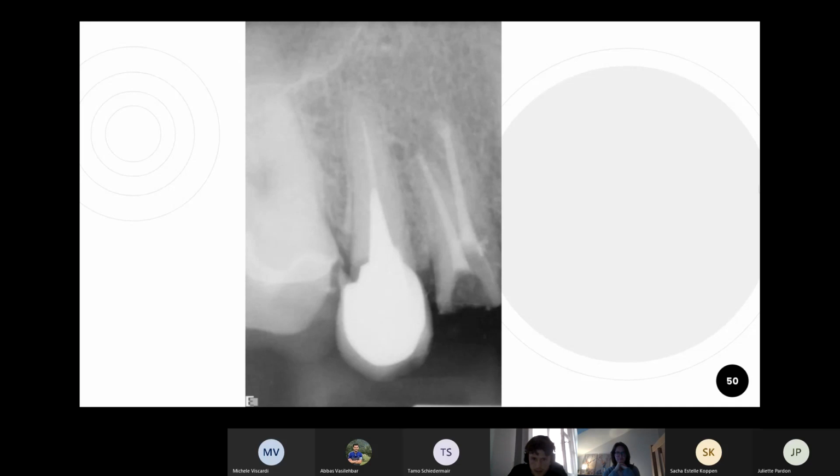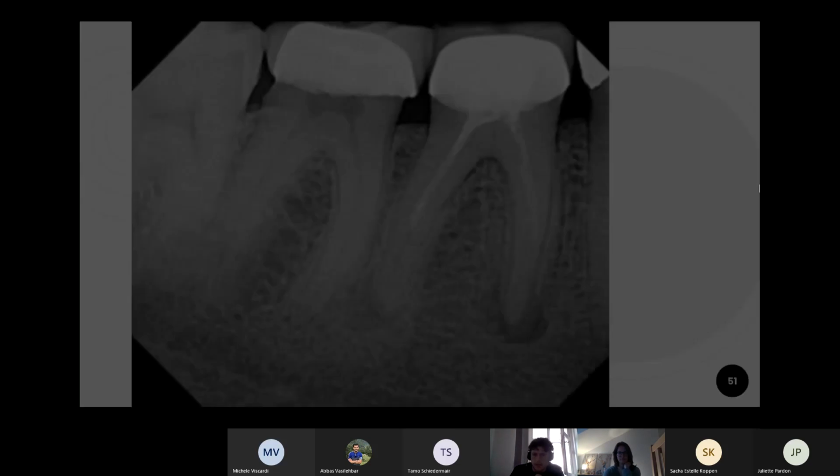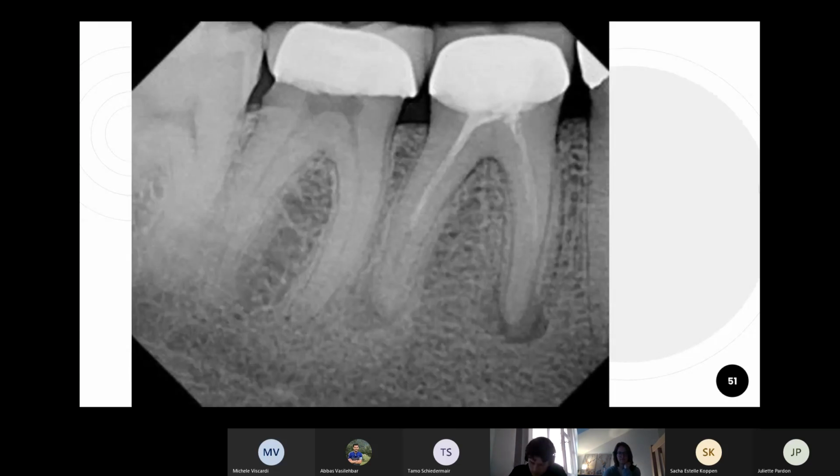It has a root canal inlay with a facet crown on top. You see secondary caries distally, definitely under the inlay. And also you can see 1-4, the crown is completely destroyed by decay, and it also has been endodontically treated. So yeah, that's basically all there is to say about this X-ray. And then to the last one. Yeah, I can give you a few seconds again, and then I'm going to tell you what's to see here.